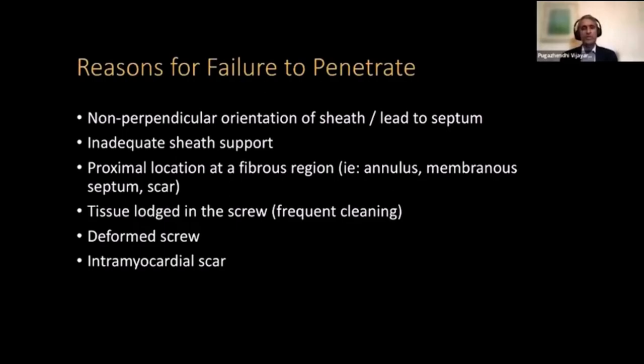You should be ready to replace the lead, because a bent screw affects not only the future electrical characteristics, but also the acute implant, and may even make it harder.